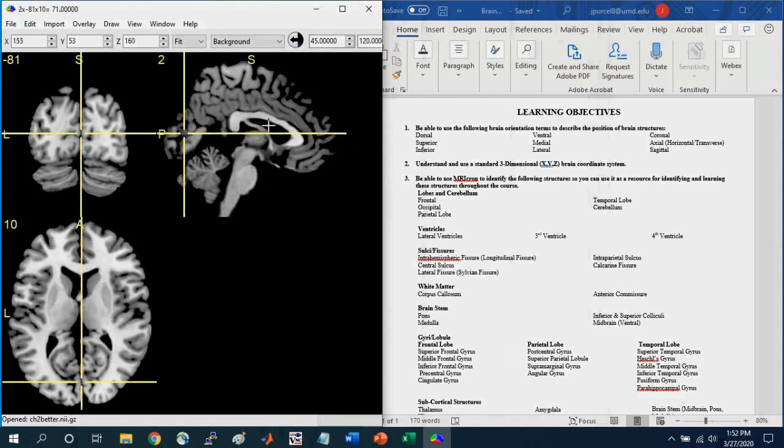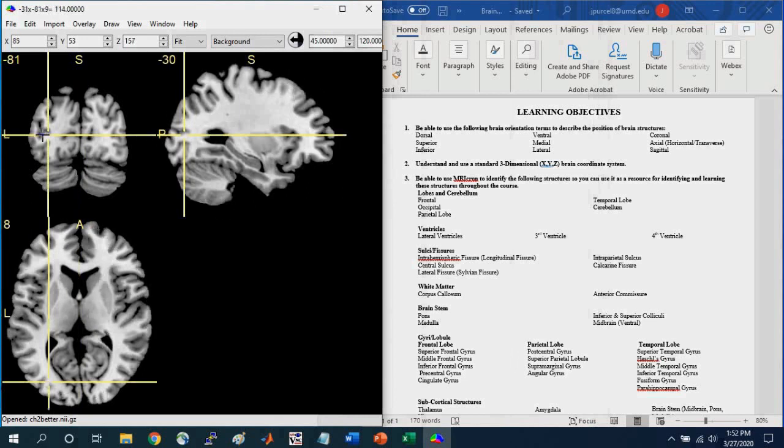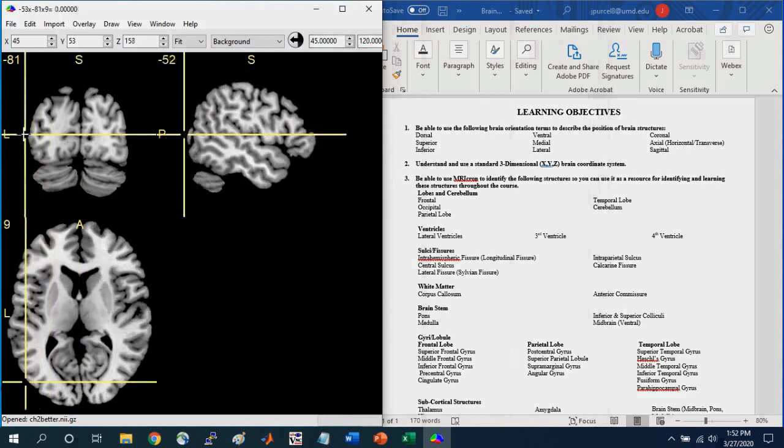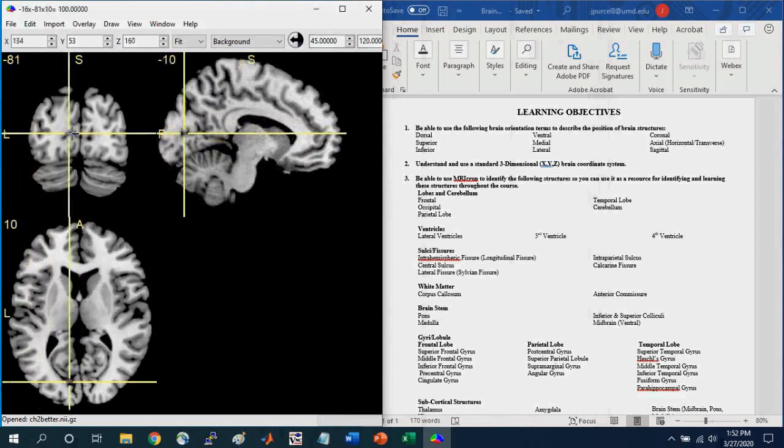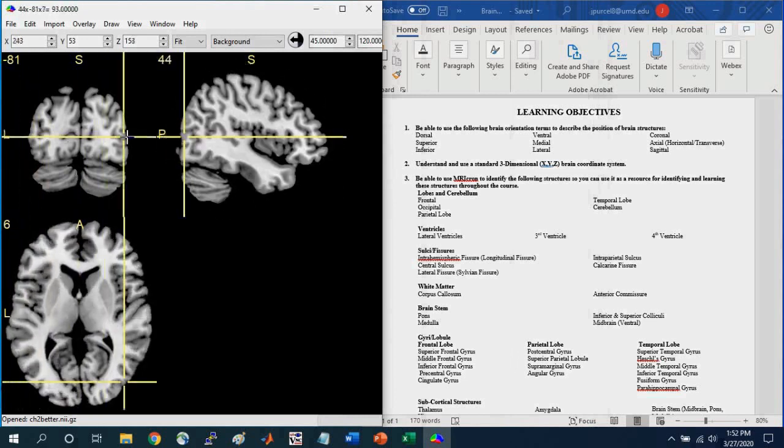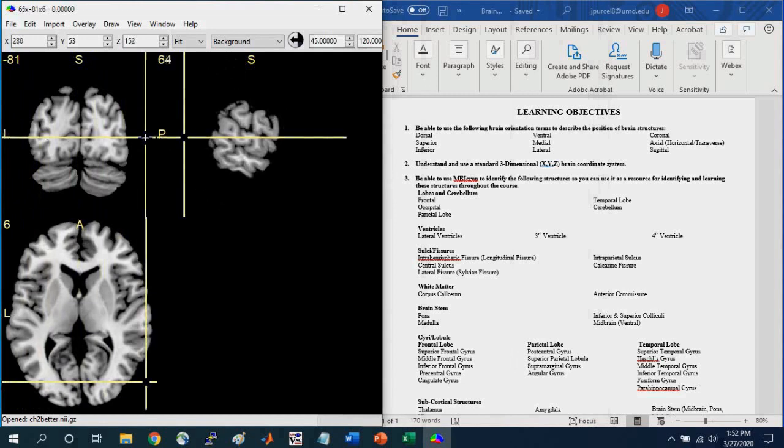And so here in the sagittal, you can see a mid-sagittal slice. And if I go more laterally, it's going to either end, either the left or to the right. So lateral just means going out to the side, okay?